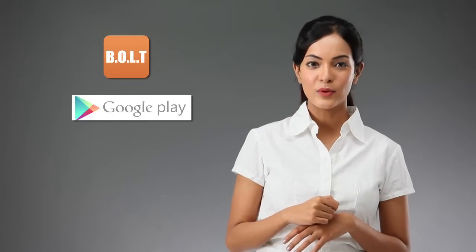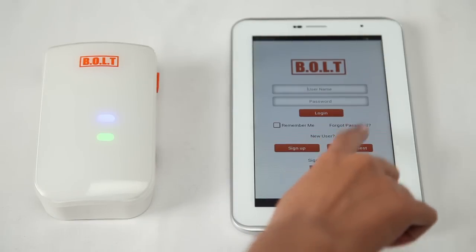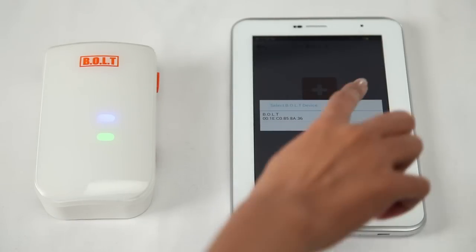Using the Bolt device is very simple. Download and install the Bolt app from the respective app stores. Unpack the Bolt, switch it on and pair it with your device using Bluetooth.